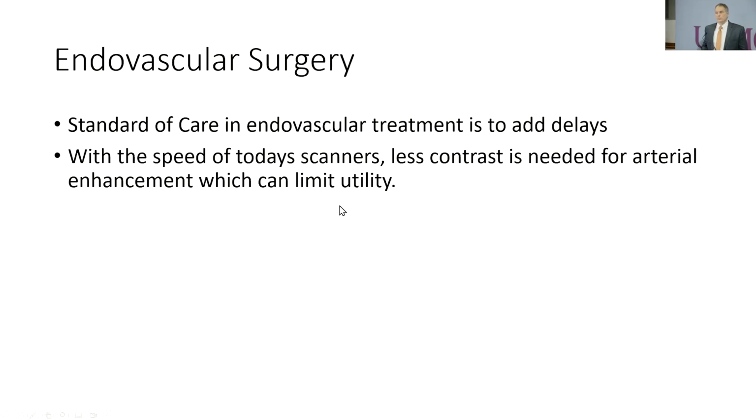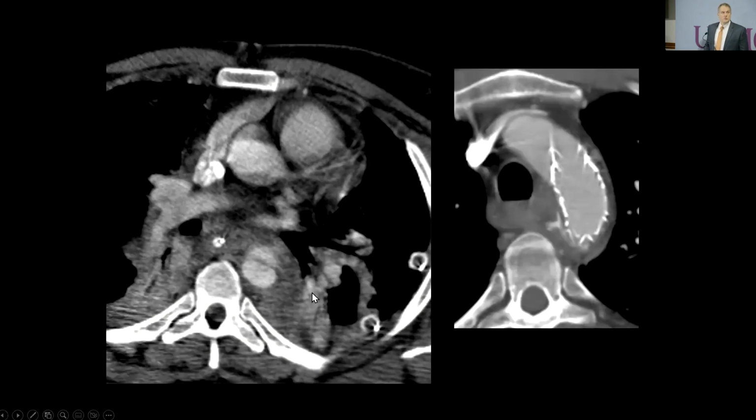And then in endovascular surgery, we add delays. You do have to be careful today. With reduced dose protocols and faster scanning, we are using less contrast, which limits the overall enhancement with delayed images. Delays are dependent on the volume of contrast, not the rate of administration. And so you have to be careful in using that. And obviously, we look at things like the bird beaking.